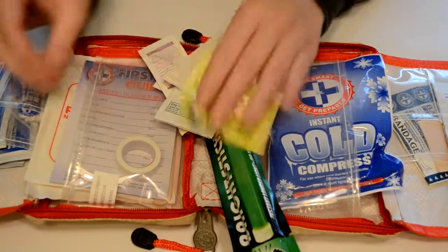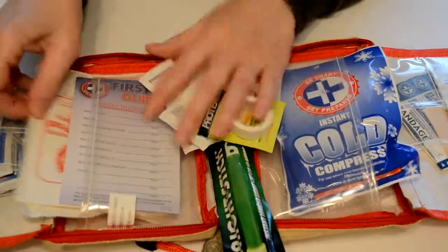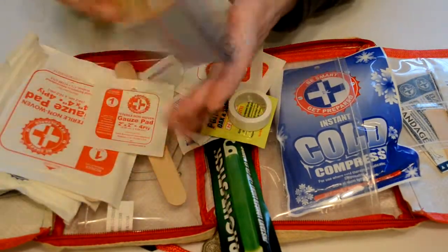We've got some poison ivy, poison oak, and sumac cleanser towelettes in case you get into some poisonous plants. We've got some tape for gauze pads, and a little sheet here for first aid.